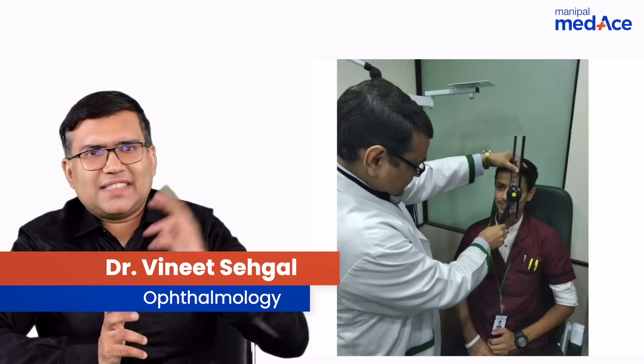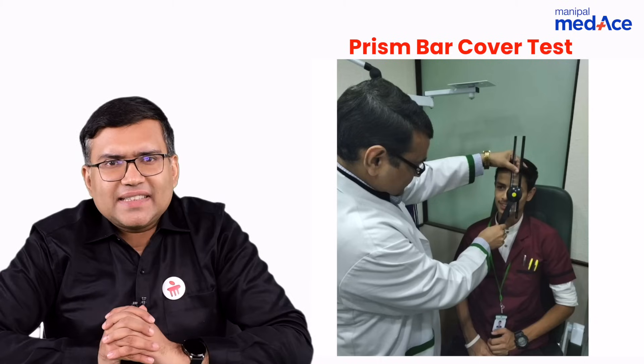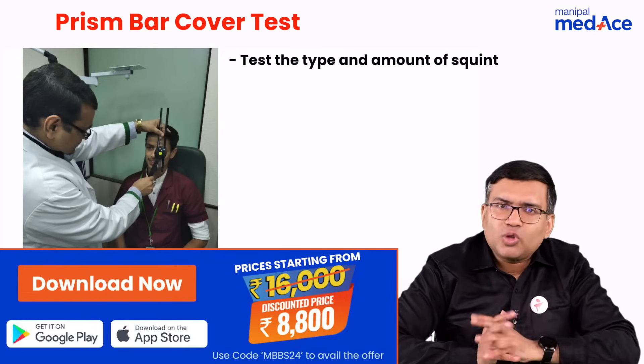Hello friends, what is this test being done here? This test is called prism bar cover test. What I want to know in a prism bar cover test is first of all the type and amount of squint.